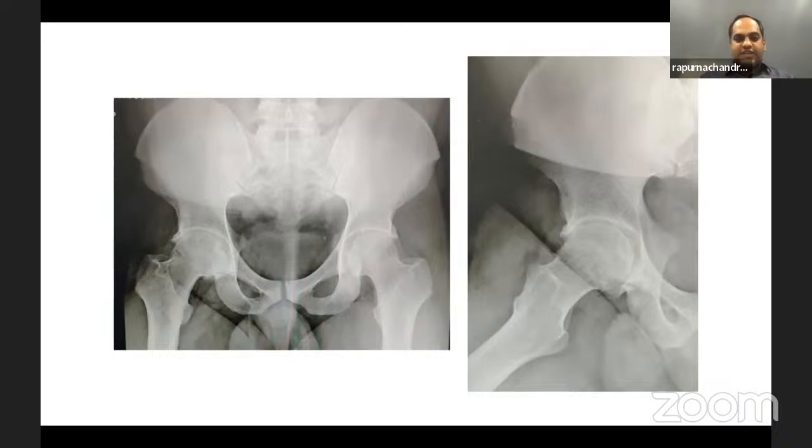The only thing that was positive in this case was there was a little bit of joint space over the anterior and the medial aspect, but you see that there is a global overcoverage, there is a central osteophyte. So I was very skeptical about doing hip arthroscopy for this case. But this was a doctor's brother. I was in fact forced to attempt an arthroscopy for this patient.